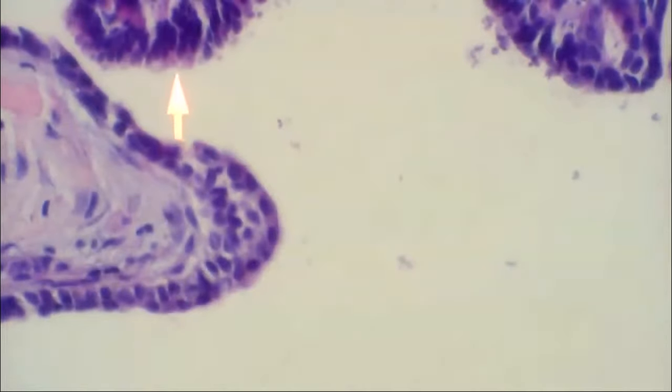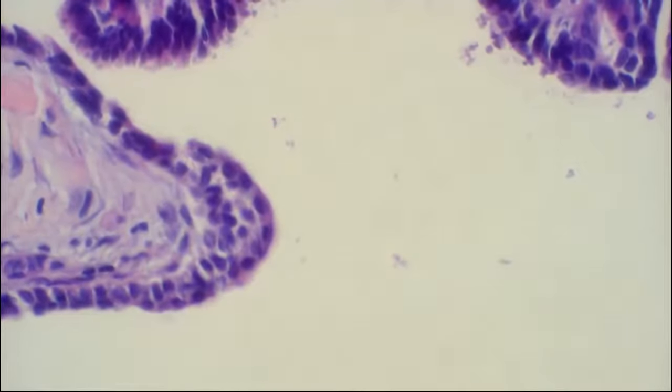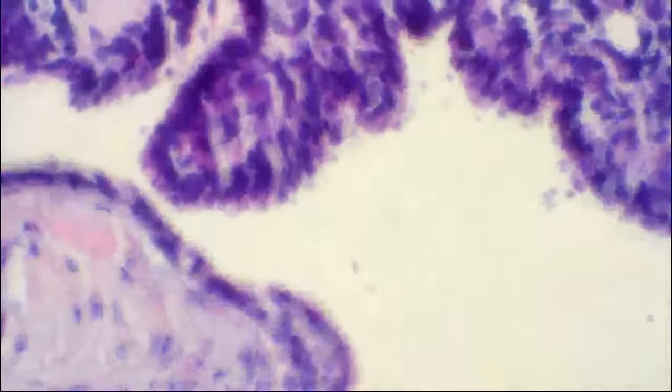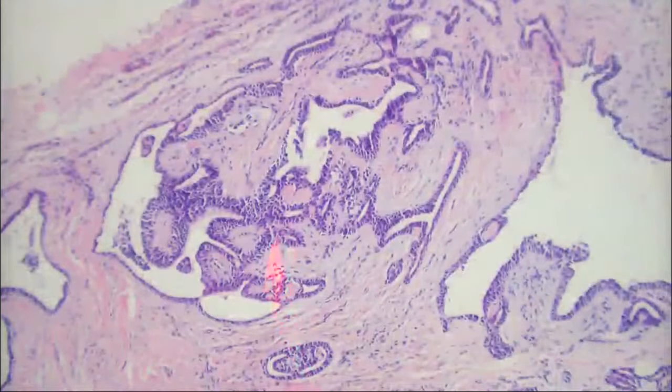So what kind of differentiation is that? If it's like a gland, what kind of gland? Apocrine. Yes, apocrine. So we have an apocrine cyst, right? Okay, so what's the diagnosis? Apocrine hydrocystoma. Well, that's close. But what's a little different about it than that? Is that an apocrine hydrocystoma over here?